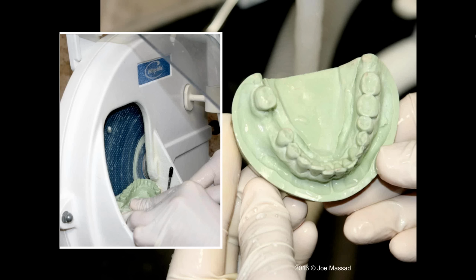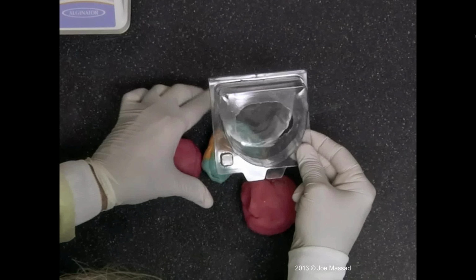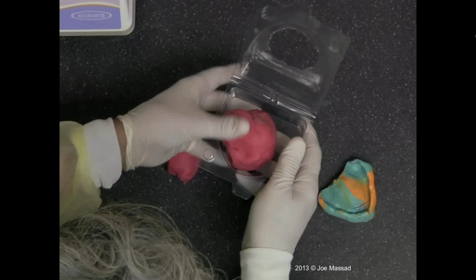So here's one for just an upper denture. Once again, cut the handle off, size it. I just cut a hole in the container. Now I'm going to go ahead and put the material in. The tray fits fine since the handle's cut. And now I'm mixing. Actually, this is already mixed. I'm just compressing this into the container here.